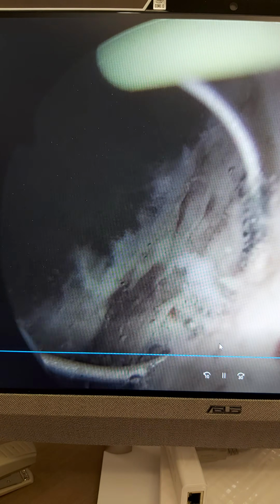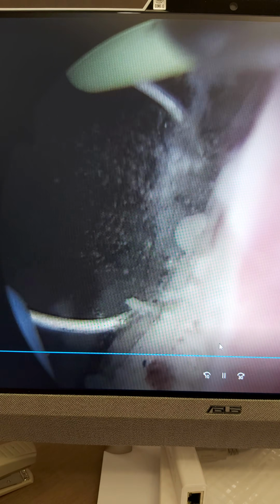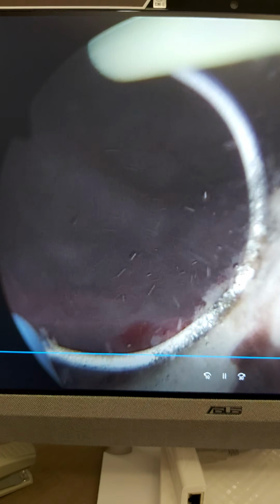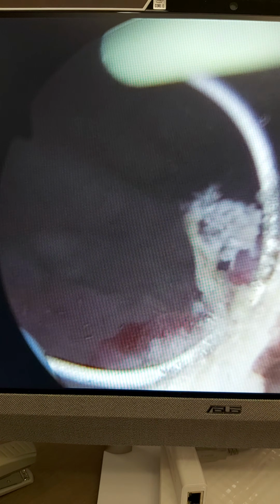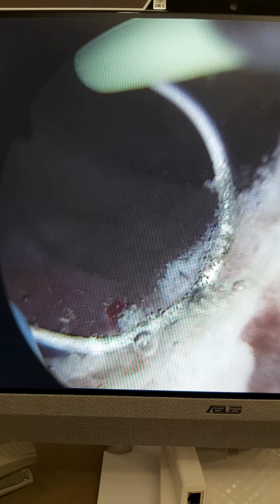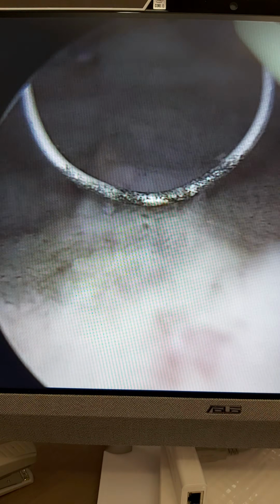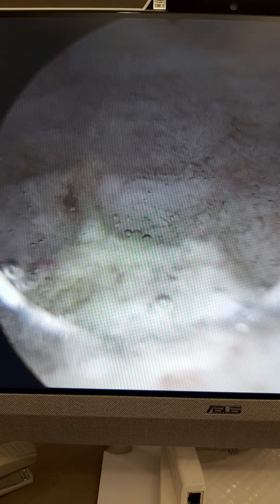So in this video, I tried to demonstrate what happens in the long run to leukoplakia tissues if fulguration is not done at a proper age. This is a 70-year-old lady, and she had no treatment for years, and her leukoplakia tissues, her infected bladder, became more and more infected, and these abnormal little cystic ball-like tissues formed in her bladder.